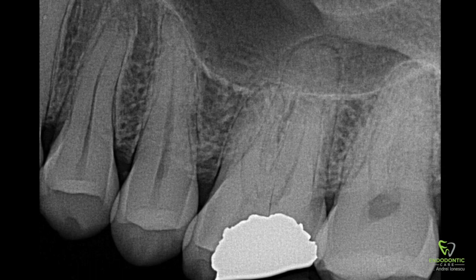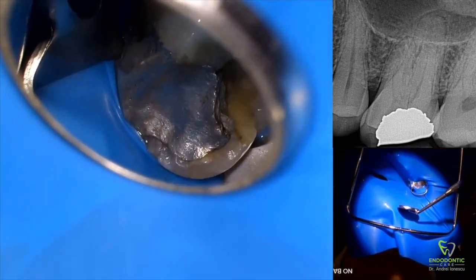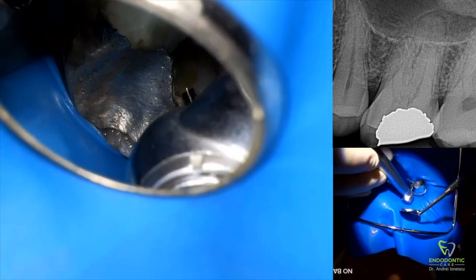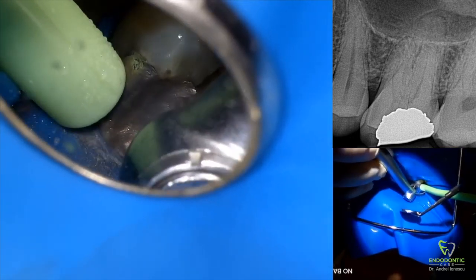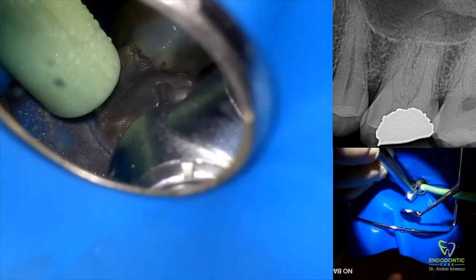Today we're going to be discussing tips and tricks on how to negotiate a really calcified canal. In this case we're looking at a maxillary first molar. The tooth is pretty heavily restored — it has a large amalgam filling and has had a cuspal fracture. As you can see in the x-ray, the canals and the pulp chamber are very calcified, and we're going to review techniques to negotiate these canals and achieve a smooth and reliable glide path.